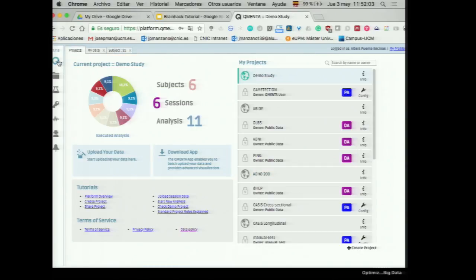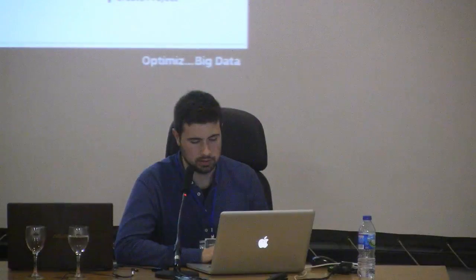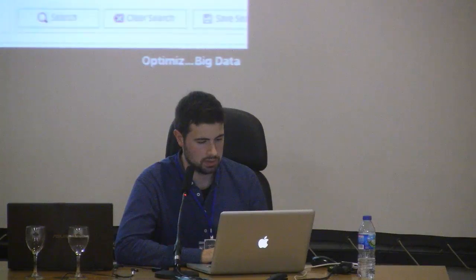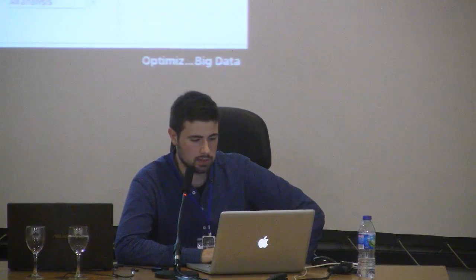Then another nice feature of this is that, depending on your study, you might want to conduct some statistics on this without having to fetch all the data and do the scripts yourself. So if we go, for instance, I will just pick one of the projects, and then go to the data, and then you can do here project quality. This will show you the distribution for this study itself.